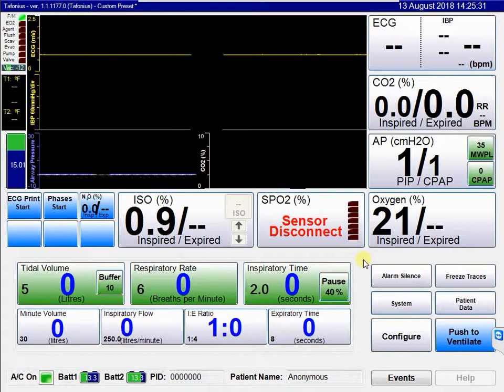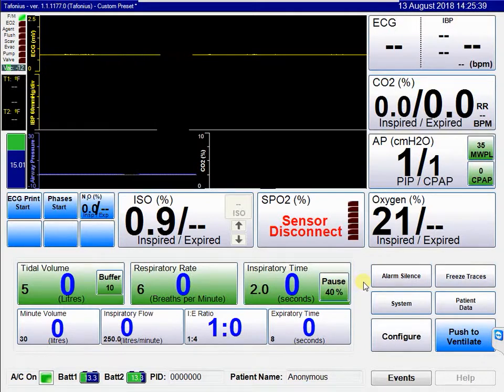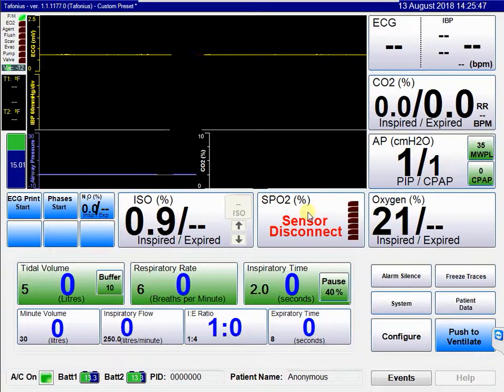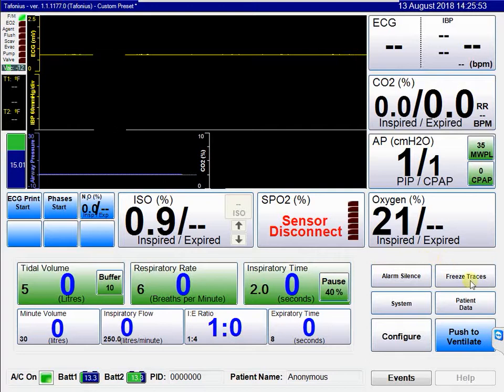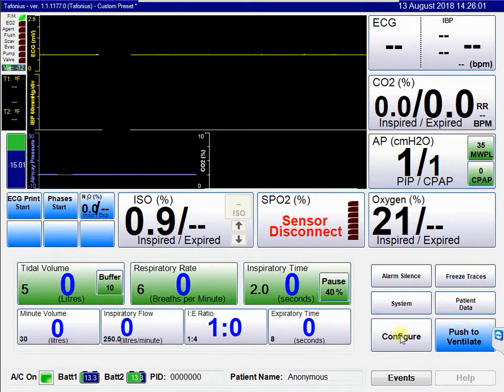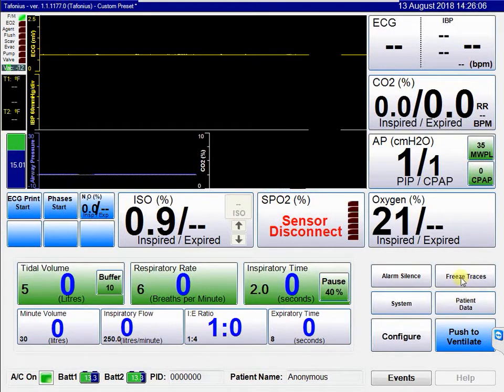When presented with the Tofonia screen, we have a number of regions of buttons. We have the green user control or ventilate buttons, the parameter buttons — ECG, CO2, AP, oxygen, SpO2, and ISO — and the setup buttons in the bottom right corner, which include alarm silence, freeze traces, system, patient data, configure, and the push to ventilate button. This video will describe the action and uses of the setup buttons.